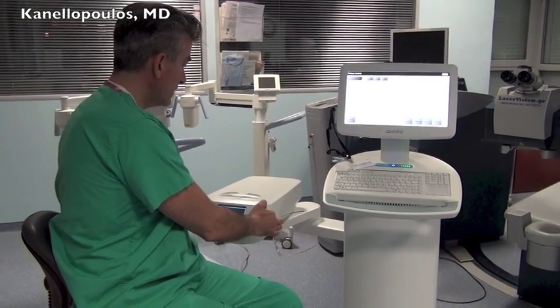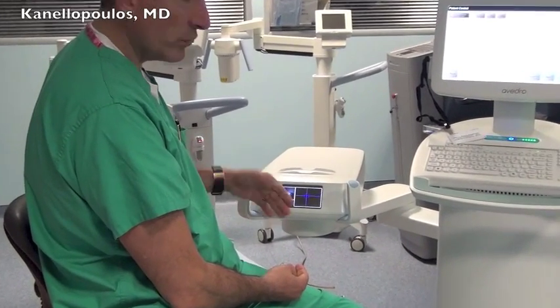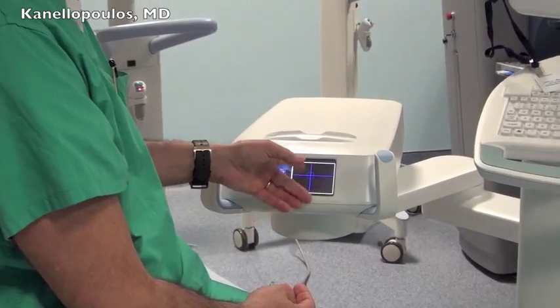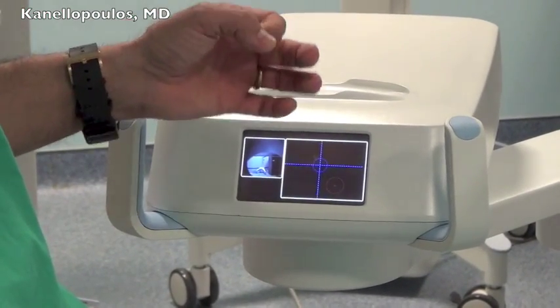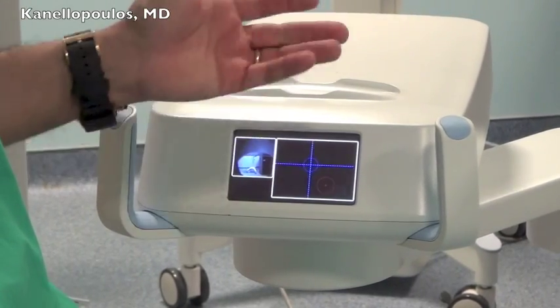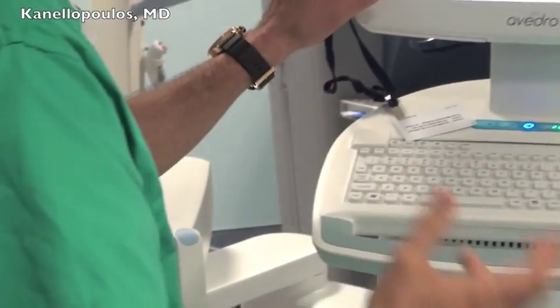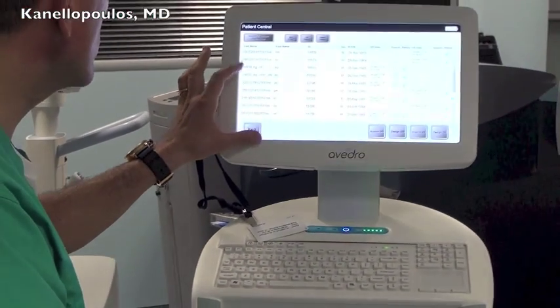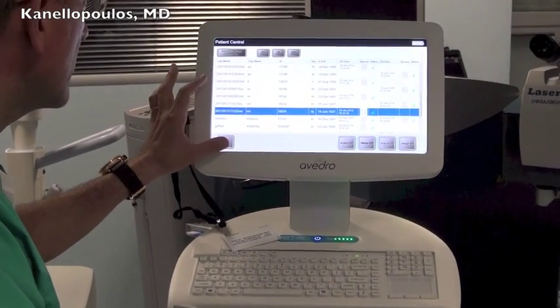This is magnetically locked and unlocked, and it has a nose camera, as you can see here. We'll see it later in action, and an XY axis with a tracker to track the actual pupil of the patient during the procedure. What's very exciting with the PiXL 2 is the fact that we can really customize treatments to pretty much any extent.